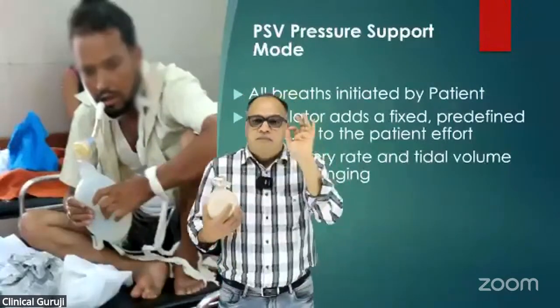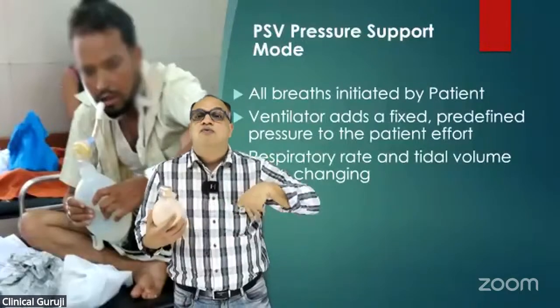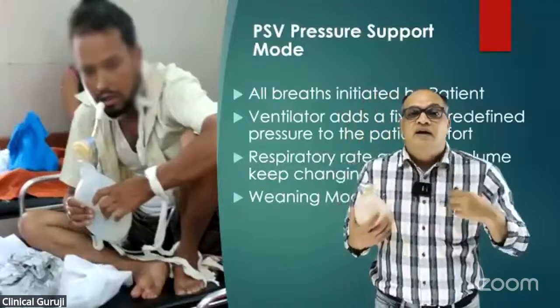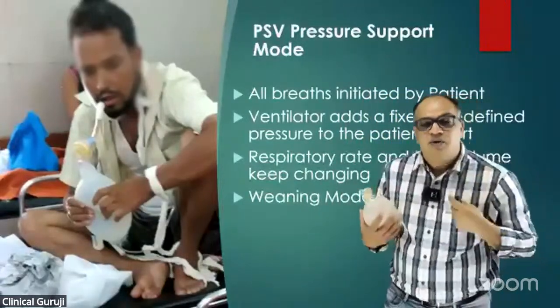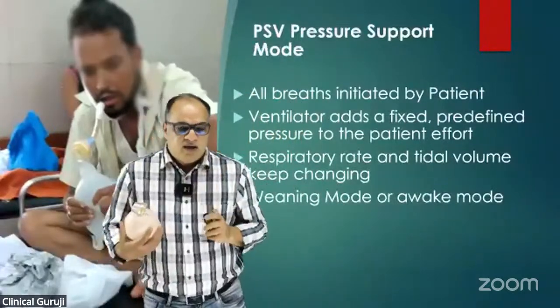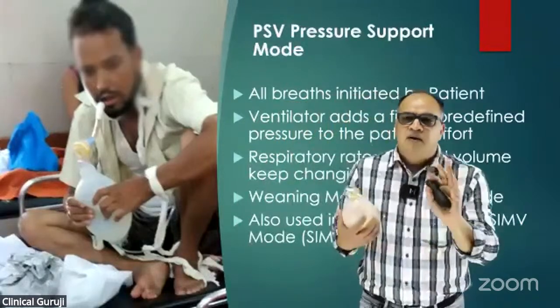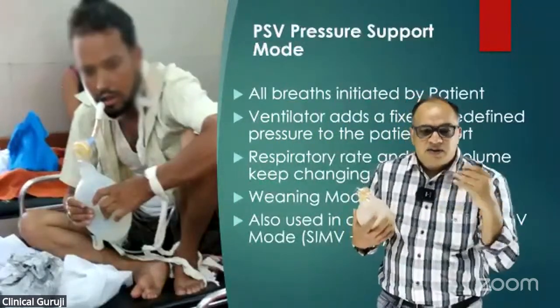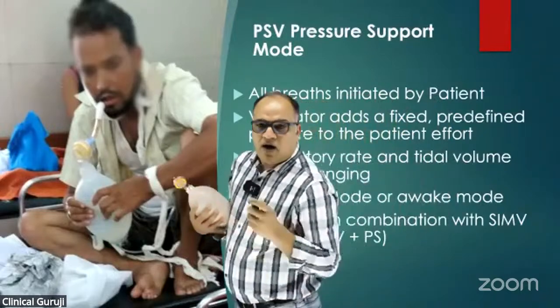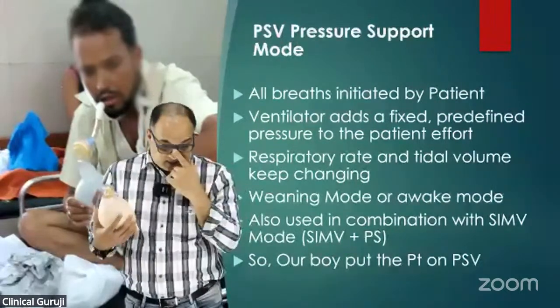Right now, PSV, the pressure support mode, was a very good mode for weaning, for an awake patient, for a patient who can decide when he wants to breathe. So this is a very good awake mode, and it is used very much in weaning along with SIMV. It is called SIMV plus pressure support. So our boy put the patient on pressure support ventilation.